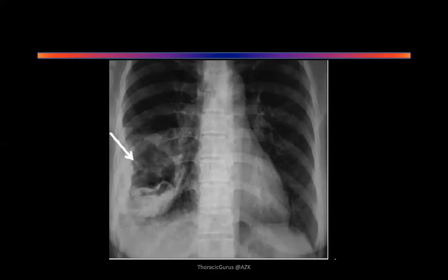This looks like a chest X-ray PA view, sir, because cardiac shadows are well defined. In the right lower zone, we can see a cystic cavitary lesion with an air fluid level. The cavity margins are well seen, and at the base of the cavity there is fluid, maybe an abscess. Differential diagnosis: hydatid cyst. Describe the hydatid cyst. There are a few features you can see here. This is very classic. Water lily sign, sir. Okay. Good. What else?